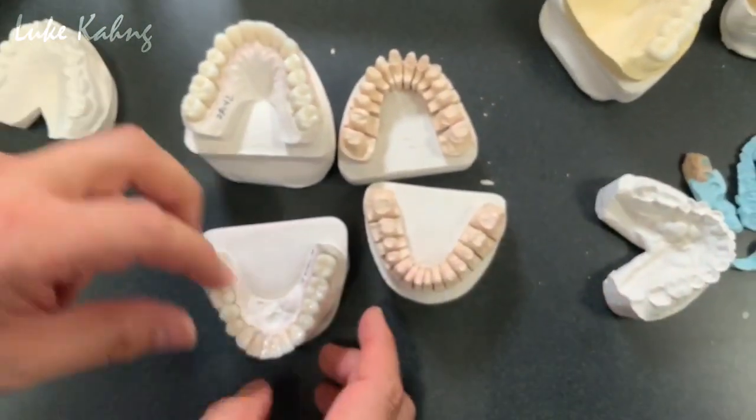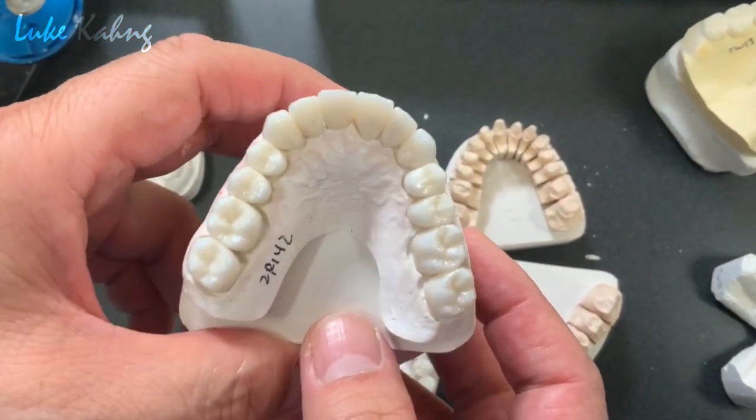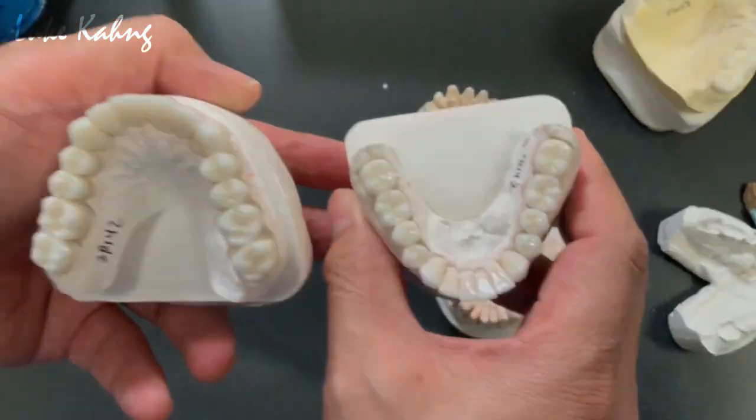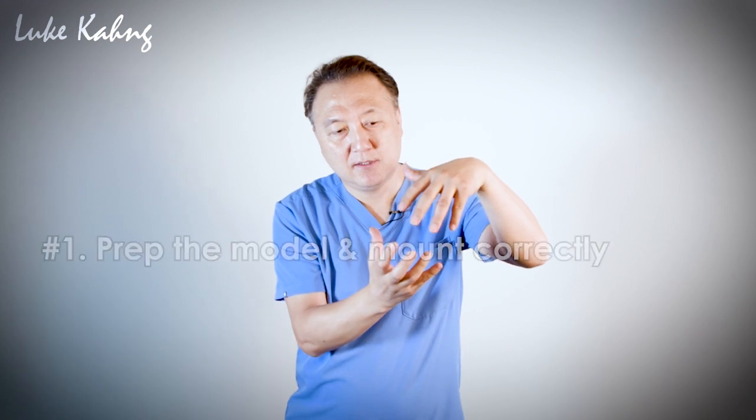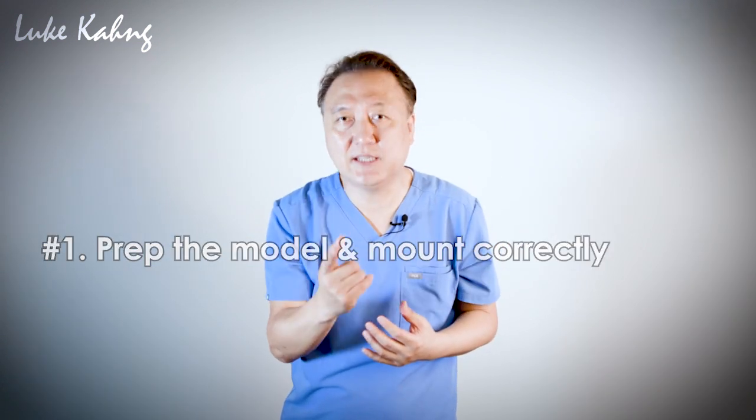And then this one is the final restorations that I have to share with you guys. And here is top and bottom, the lower. So here is the number 1 step. We have to put up this nice model, and then we have to mount it correctly. Luckily, the doctor did his nice job. We got the good vertical dimension in one time.